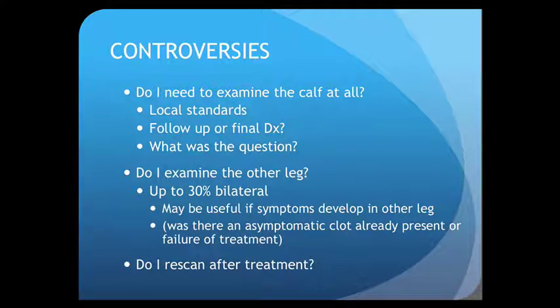Finally, what about the calf? I've touched on the calf a little bit, and I've said that technically it takes a lot more time and expertise. Now, there is still argument as to whether or not you should examine the calf at all. The UK guidelines and the American College of Chest Physicians guidelines generally recommend that you don't look at the calf at all.